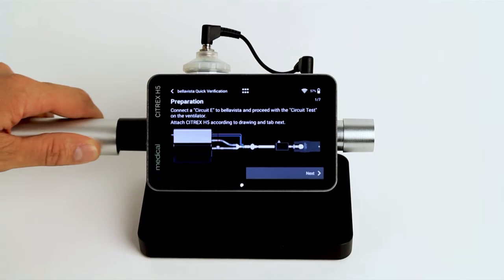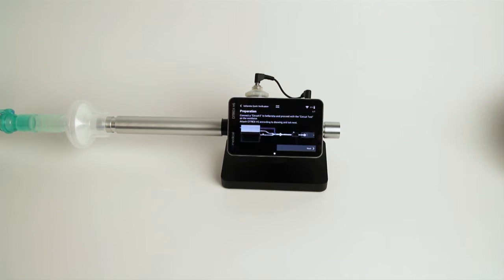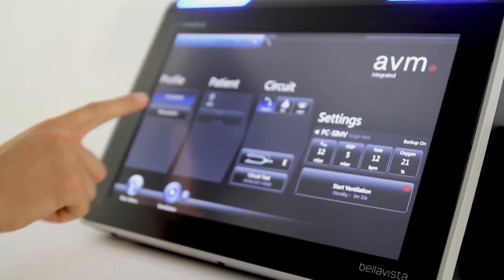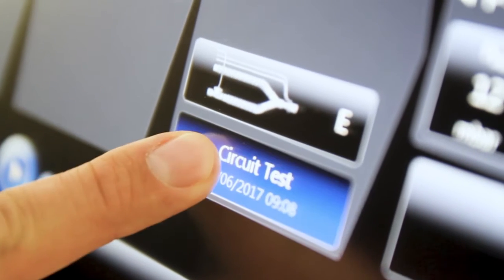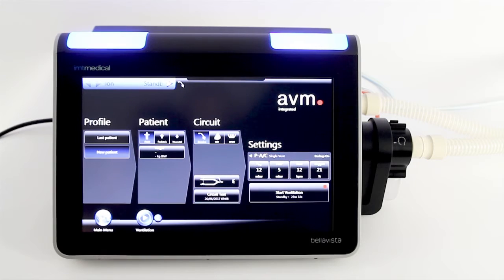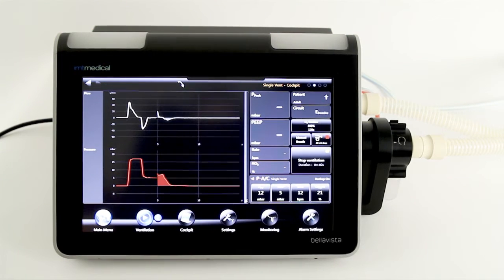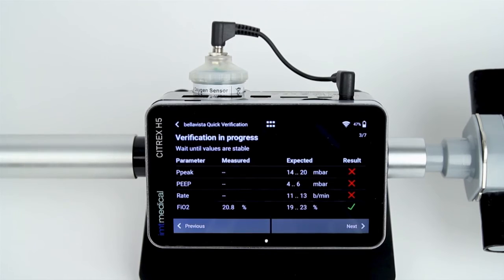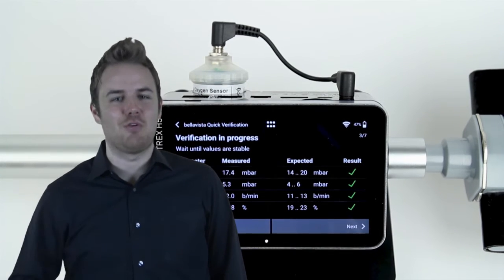Connect a Bella Vista ventilator to the Citrix H5 gas flow analyzer according to the diagram. Ensure that a successful patient circuit test has been performed before. Now start ventilation with default settings and wait for at least 10 breaths to be applied to the system. Citrix H5 gives you instant test results — fully automatic!